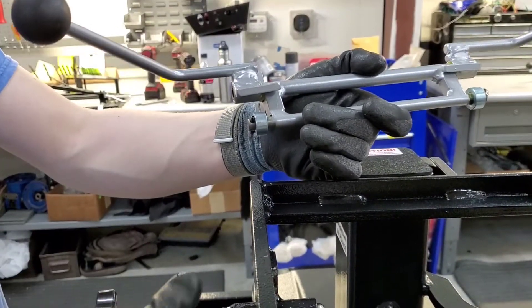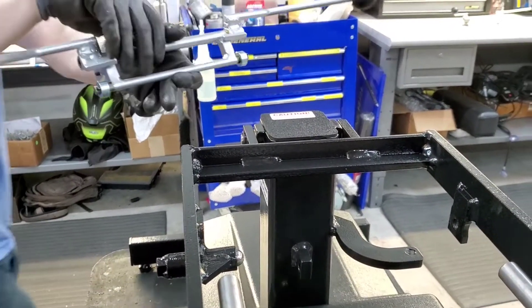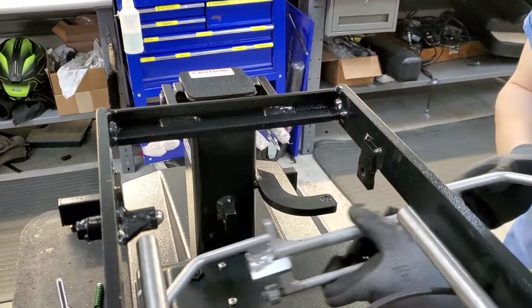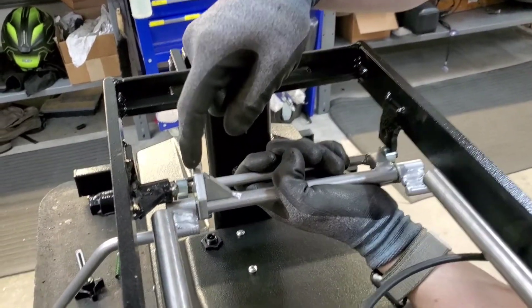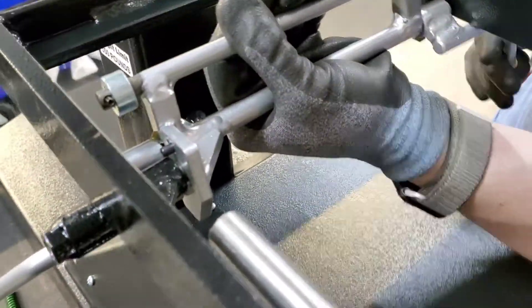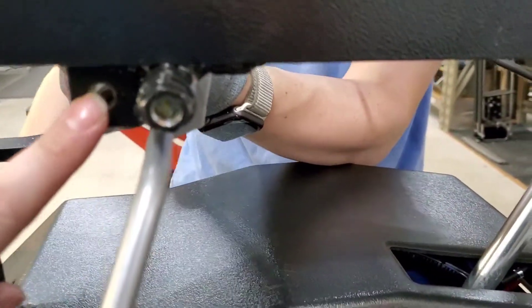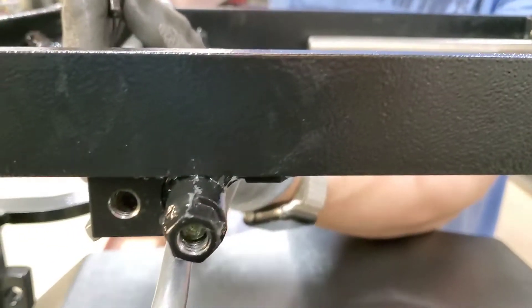We'll go ahead and put this back in, starting on the non-tension knob side. You want to get that hole in the side of the rudder lined up right in there, and the holes on either side are going to line up with the cylinders on the handle. The tab will line up with where the screw goes in, and there's another tab on the other side that does the same thing.